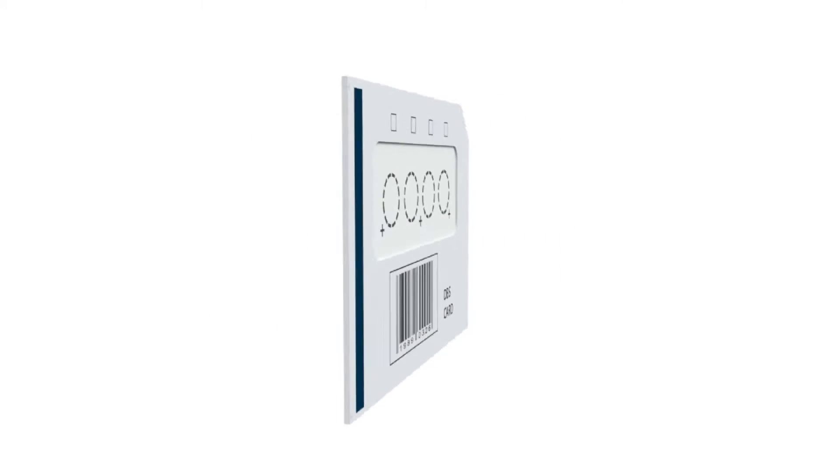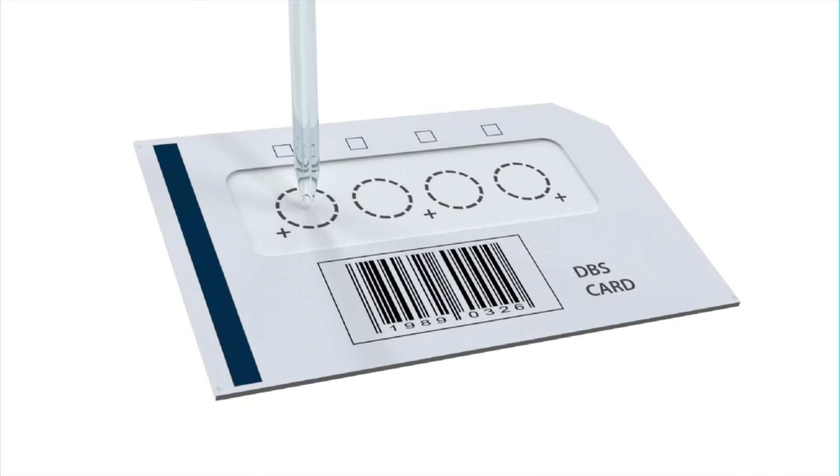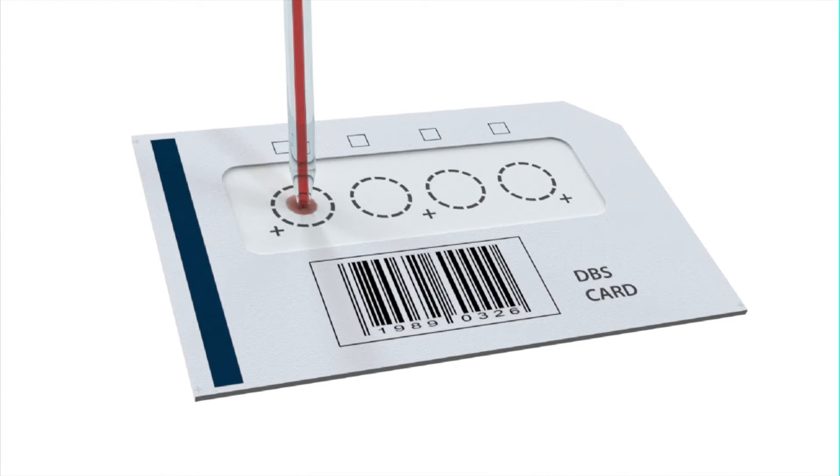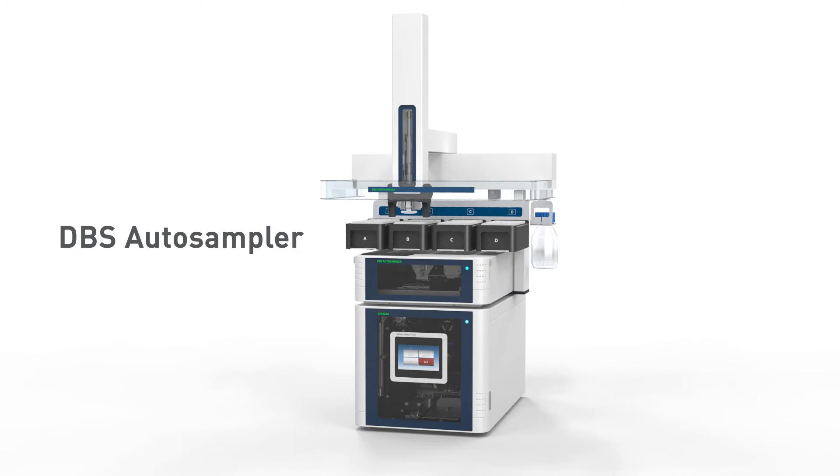A new format for quantitative bioanalysis is emerging: dried bloodspots. Spark Holland's innovative dried bloodspot autosampler with patented flow-through desorption technology enables full automation of its workflow from card to analyzer.